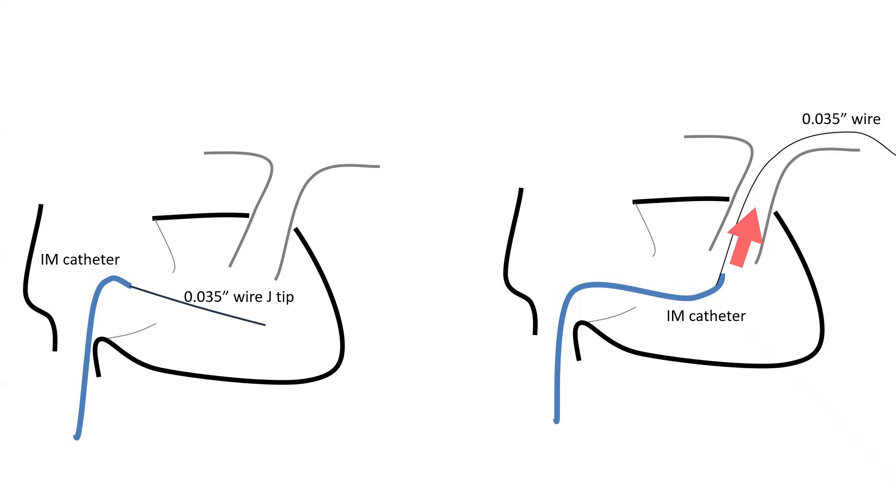So I torque it up, then as it's pointing up, I advance the 0.035 J-tip wire deep into the PA and I track over it the IM catheter.